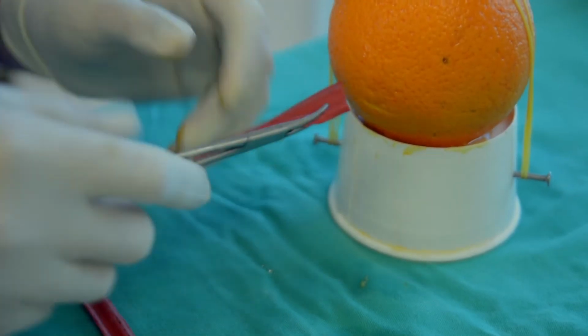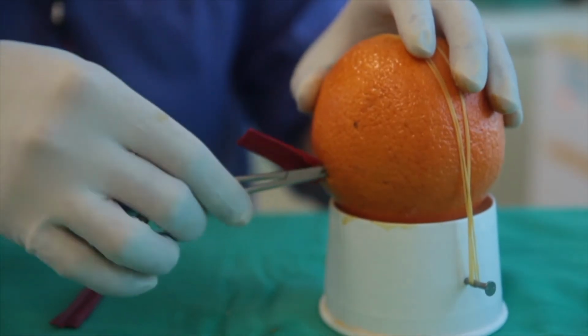By using the curved artery, you can put the drain into the opening.